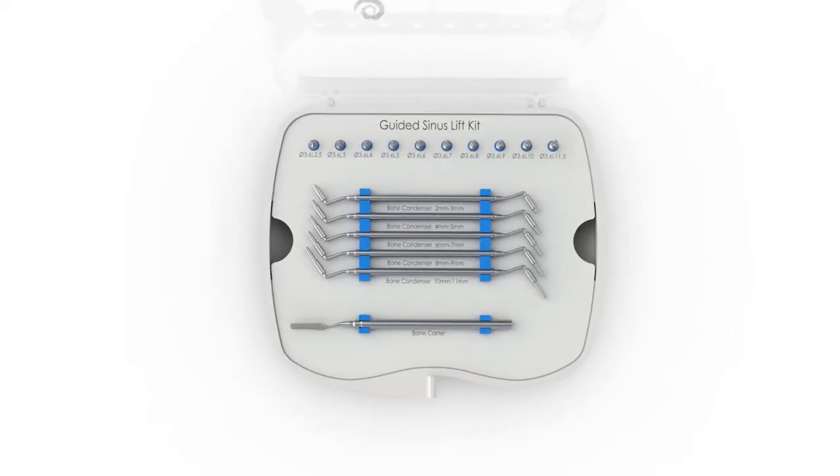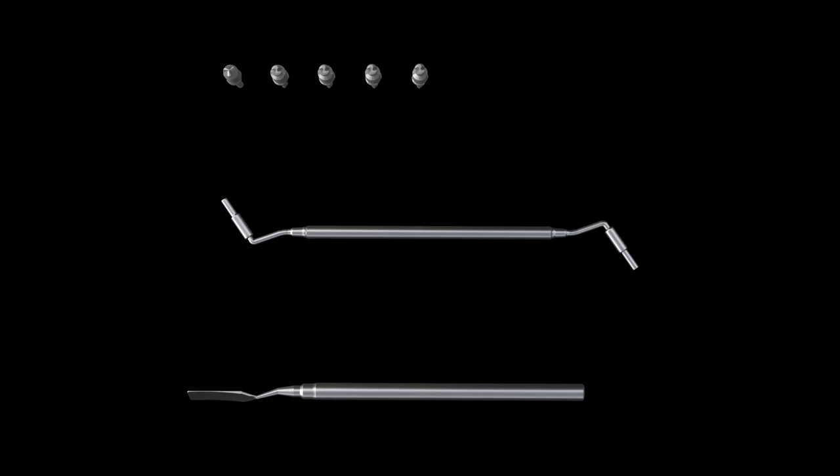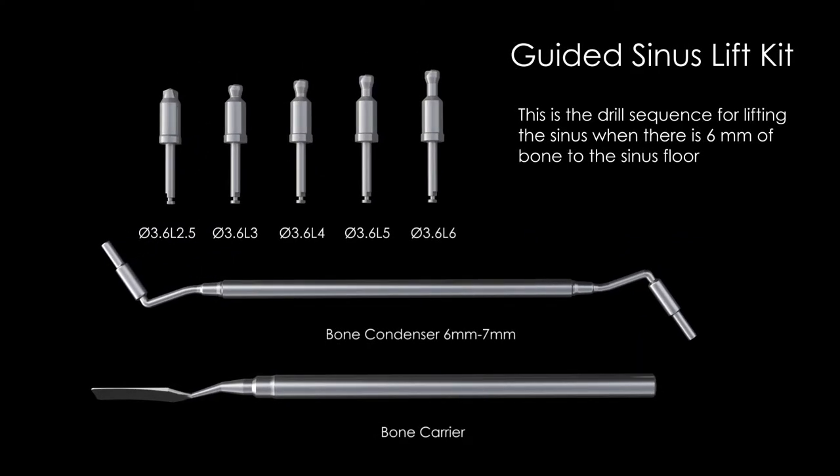The drills in this kit will not cut soft tissue and have built-in depth stops. The bone condensers also have depth stops, allowing you to avoid placing direct pressure on the membrane throughout the procedure. This is the drill sequence when placing an implant with 6 millimeters of initial bone height.